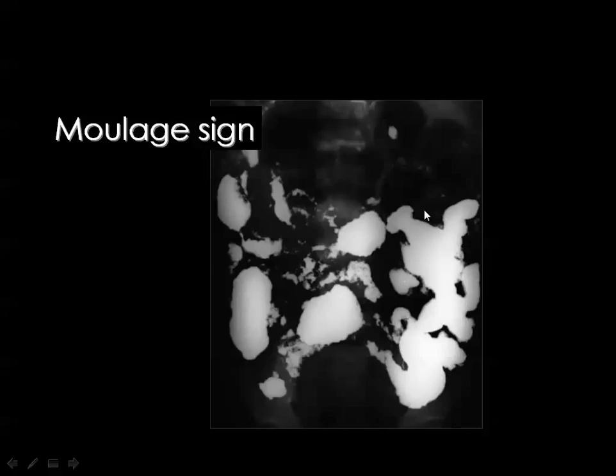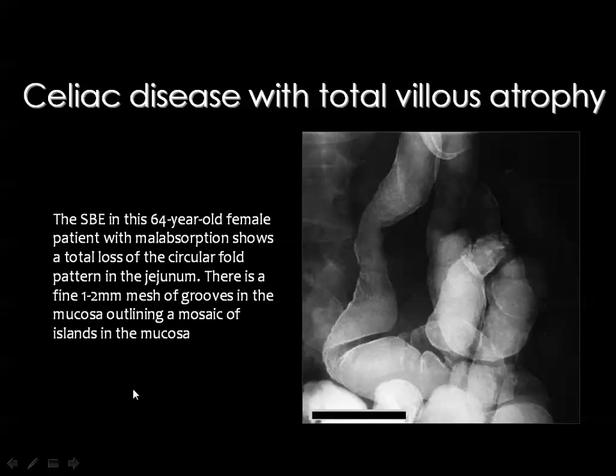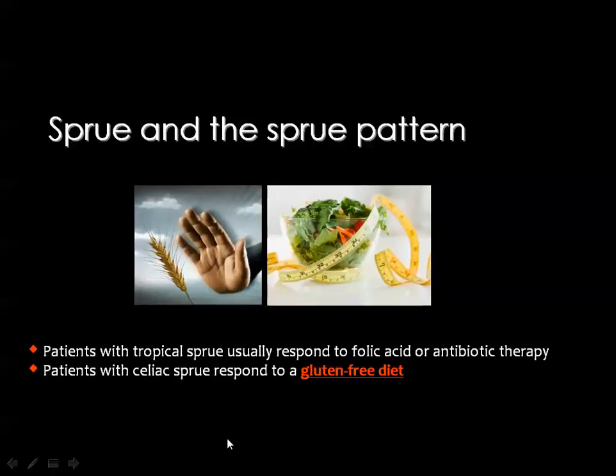You get segmentation and interruption of the flow of barium through many of the bowel loops, so you cannot judge the caliber, you cannot judge the presence of strictures and so on. Then this is the end of the story, where you can see that in the small bowel loops the mucosa is totally effaced, and you may get some areas of stricture as well.